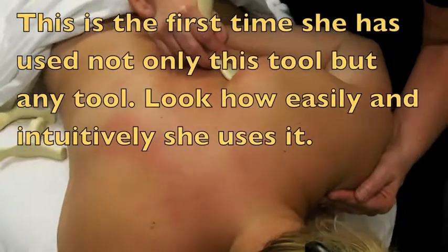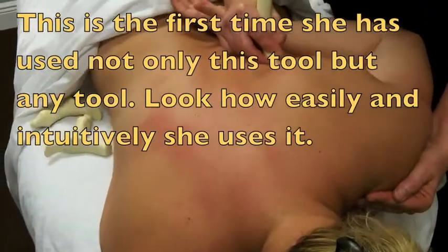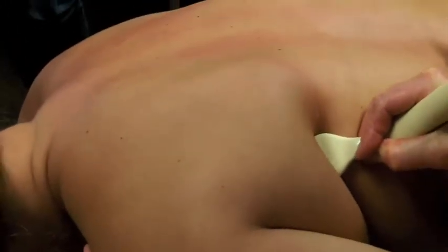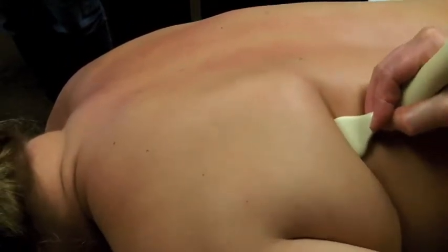So Ruth, this is about the first time you've used the tools? This is the first time I've used the tool. It's much easier than using my fingers. I can feel more because the head of the tool is right down — I can feel more with the tool than I can with my fingers. The subscapularis is probably, you know, in some areas maybe even fused to the ribs.